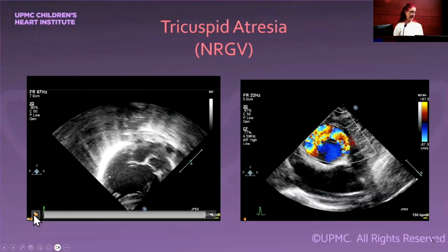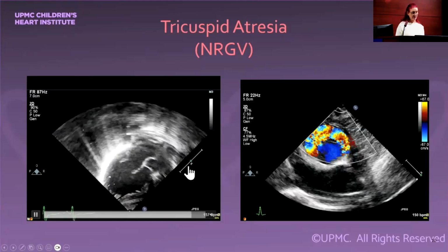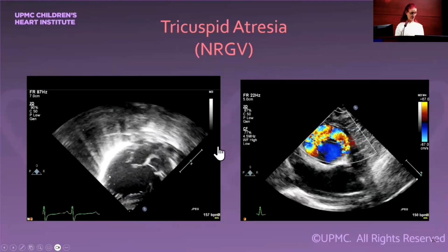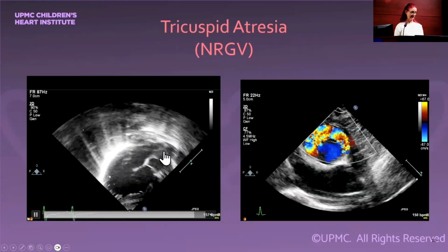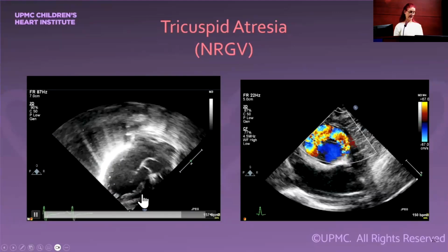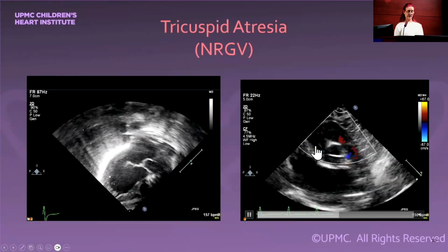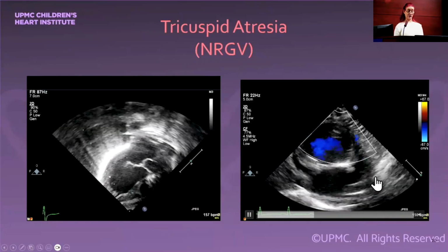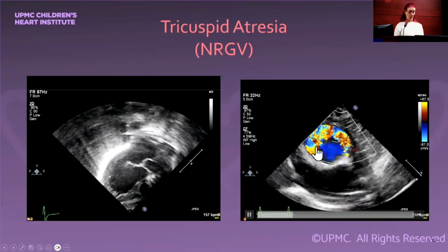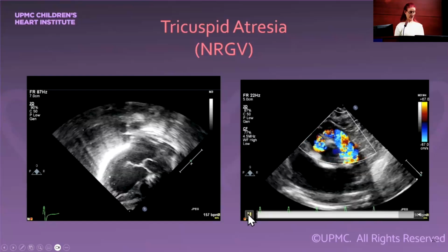I like this view when you're looking at a hypoplastic anterior chamber. This is actually an apical 3-chamber view. I'm sorry, it's a little bit off axis, so it's mitral valve, LV, aortic valve, nice continuity between the mitral and the aortic valve. And you see this small VSD in this little anterior right ventricular chamber. And looking with short axis, this is really all there is of a right ventricle in this patient. Here's the VSD, right ventricular outflow tract, and the pulmonary valve.